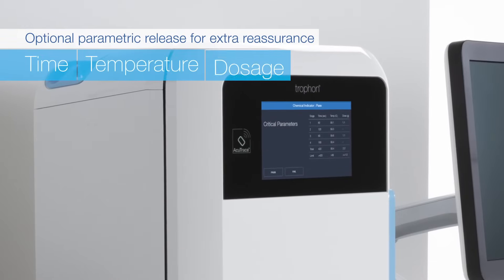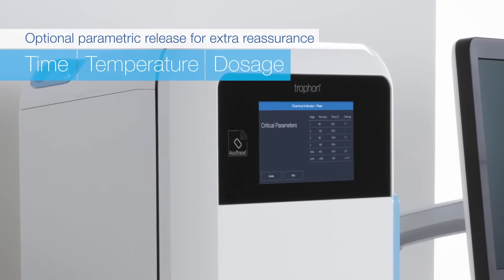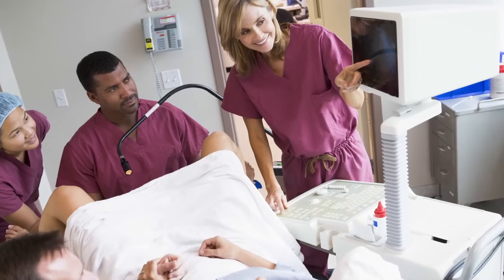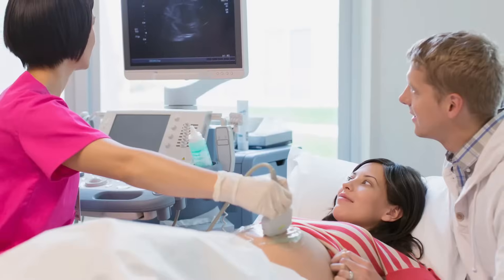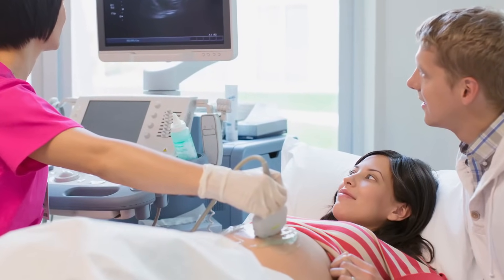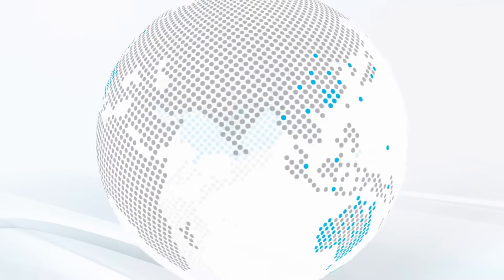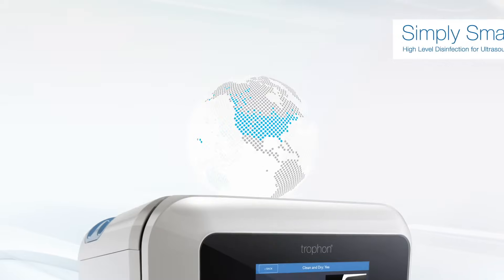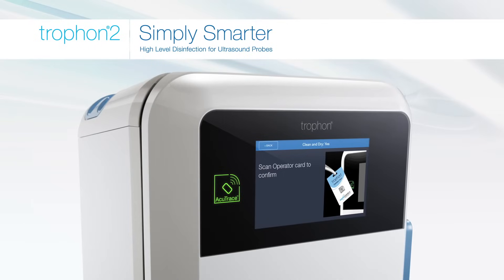Optional parametric release provides extra reassurance. Every day, Trofon2 protects thousands of people around the world from the risks of cross-contamination from ultrasound probes, setting the new standard of care globally for ultrasound probe reprocessing. Trofon: simply smarter high-level disinfection for ultrasound probes.